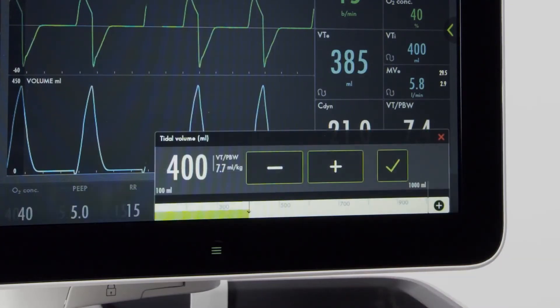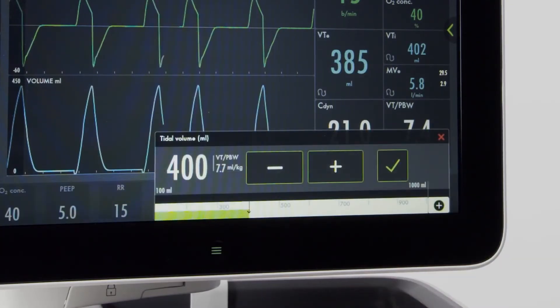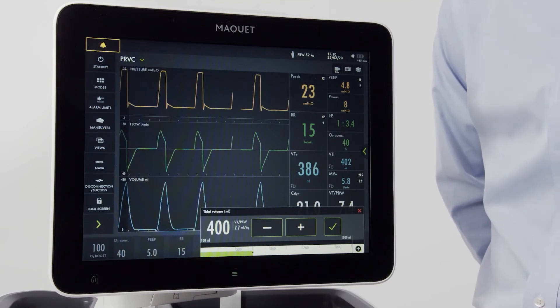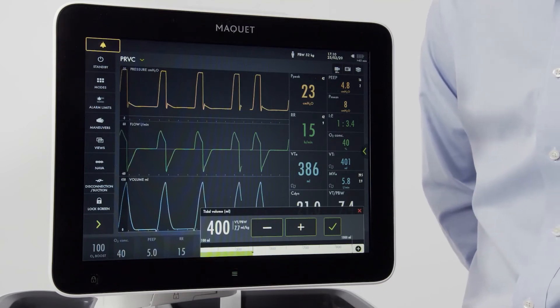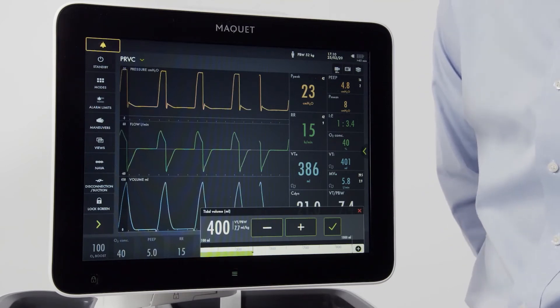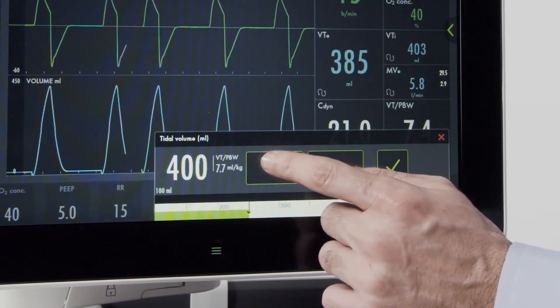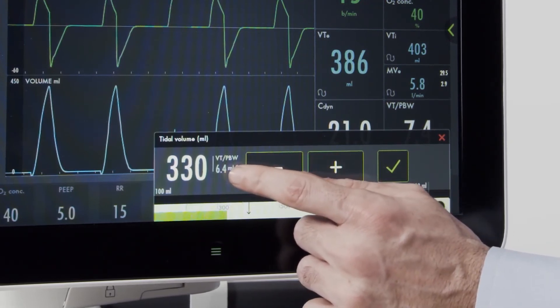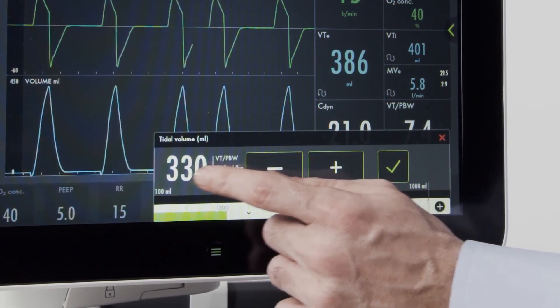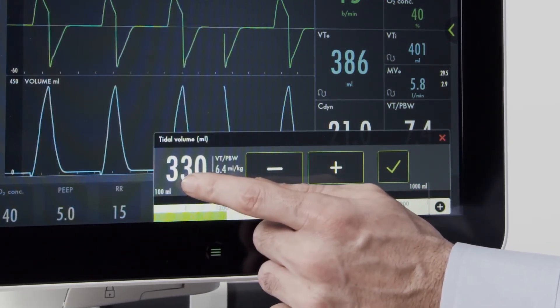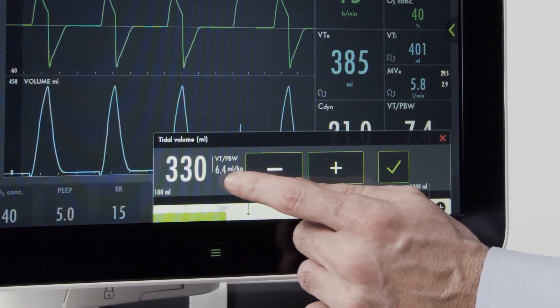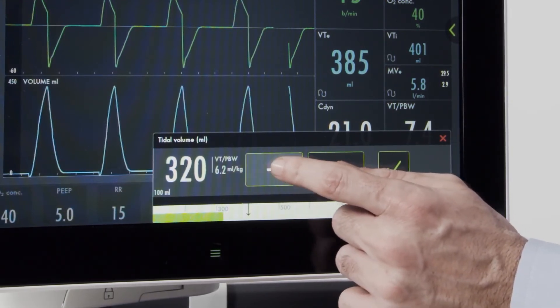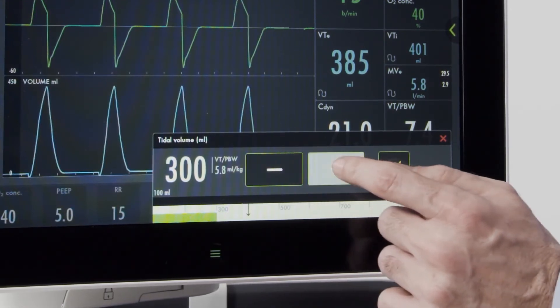When I push my tidal volume, if I want to ventilate 6 milliliters per kilogram for this patient, I can adjust that directly on the screen. You'll note that I now have the tidal volume, total tidal volume, as well as the tidal volume per body weight displayed on the screen.